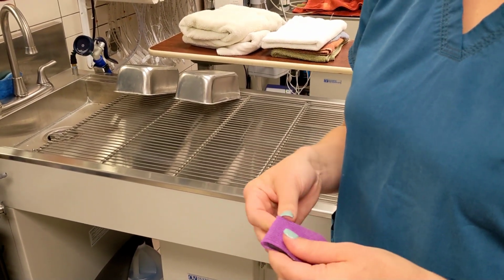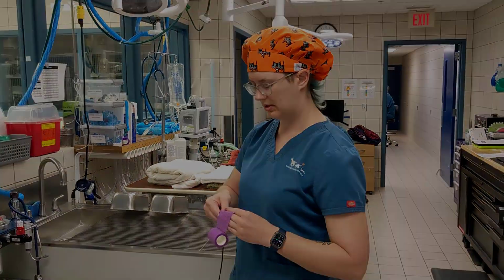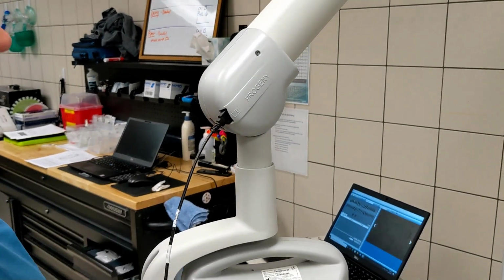It is important to change the sleeve and the vet wrap between patients to prevent bacteria and other germs from spreading between patients. Once the sensor is prepared, plug it into the port on the arm of the machine and place it safely so it does not fall.